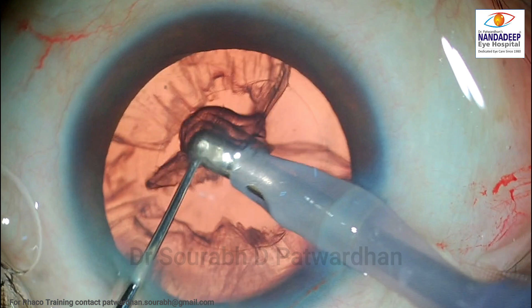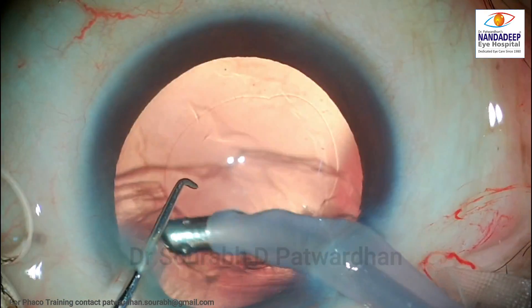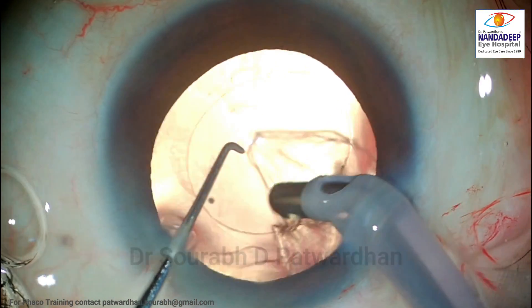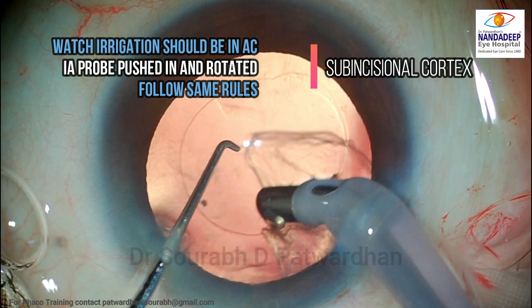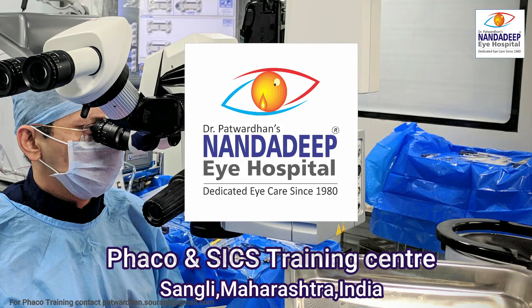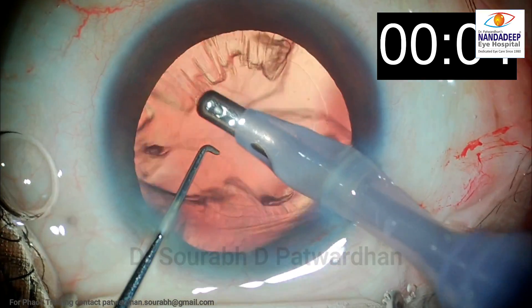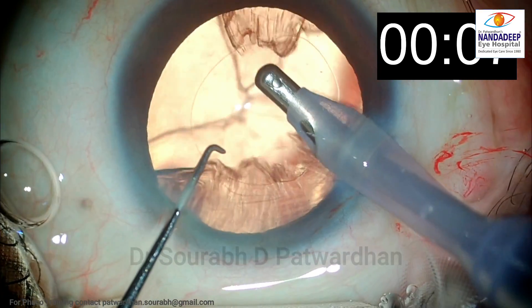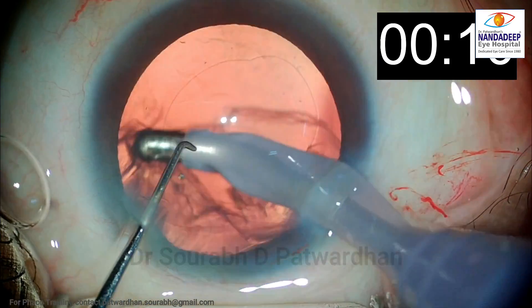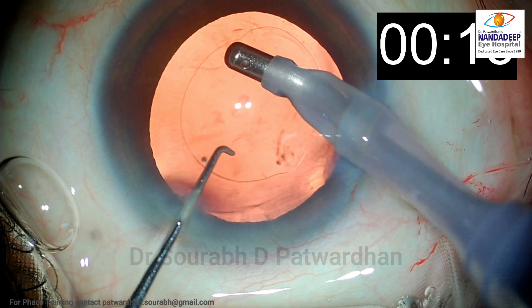The same steps have to be repeated for each part of the cortex. For the sub-incisional cortex, rotate the IA probe, making sure that the irrigation is properly inside the anterior chamber. Push the IA probe in and rotate it, then follow the same rules — using low vacuum in the periphery, catching hold of the cortex, and pulling it out. If you do each step perfectly without hurrying, you can finish cortex removal in just 15 seconds without any risk of posterior capsular or anterior capsular damage.